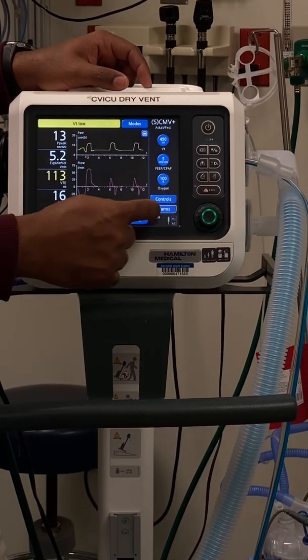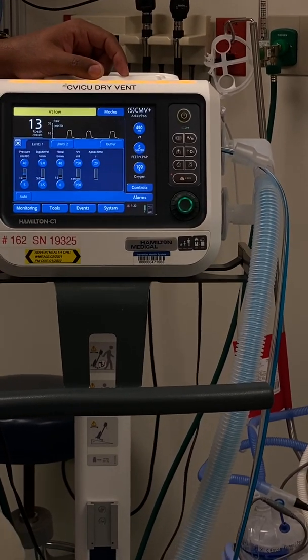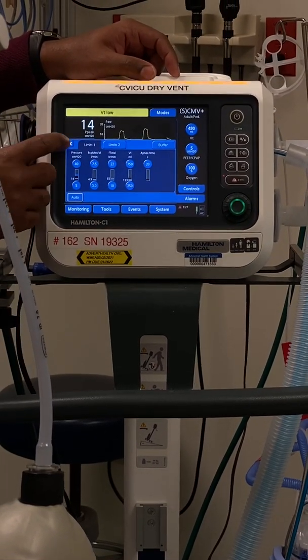Here is your alarm button and all your different alarm settings. You can hit auto-adjust and it will adjust to whatever is alarming.